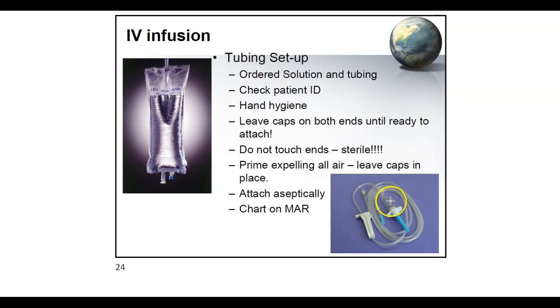Make sure you're filling up the chamber though, because if you don't fill it up, you're running the risk of having a lot of air. And when you're opening your clamp, make sure you're opening it slowly. The faster you do it, the more bubbles are going to be in the tubing. Again, the purpose of that is to expel air. Make sure you're attaching it aseptically, and if you touch somewhere when you're not supposed to, then you have to start all over again, get a new setup. And when you're done, make sure that you're charting what you've done. Don't forget to date and time according to your hospital policy, but usually you date and time the IV bags, you date and time your tubings.